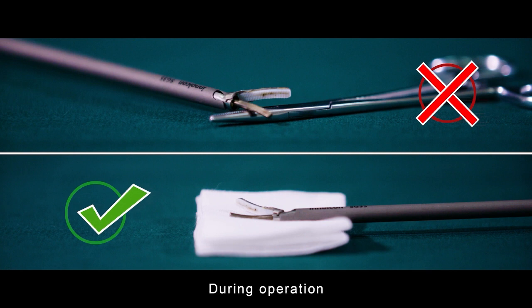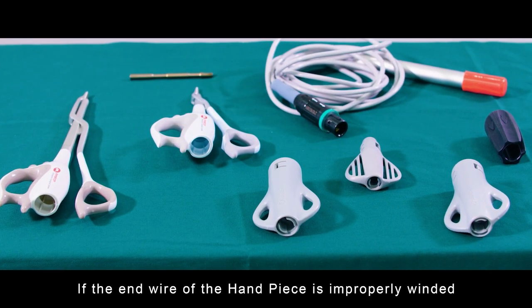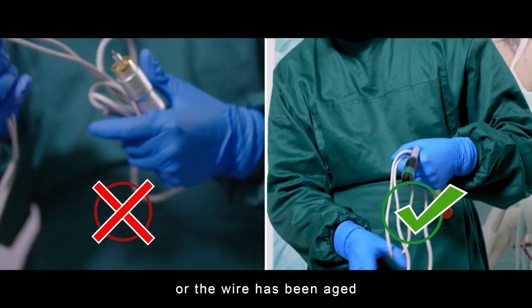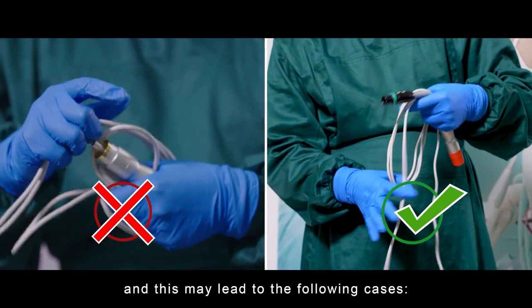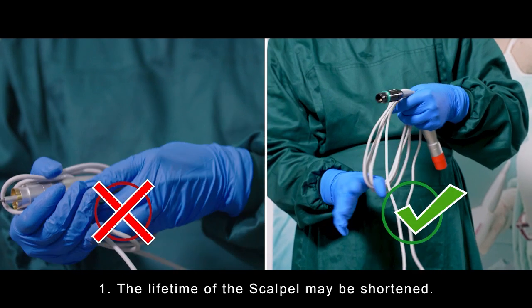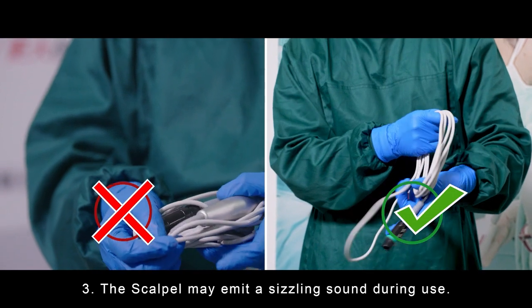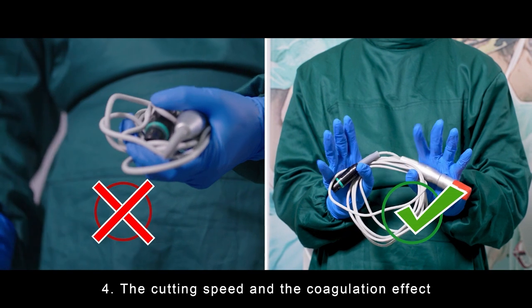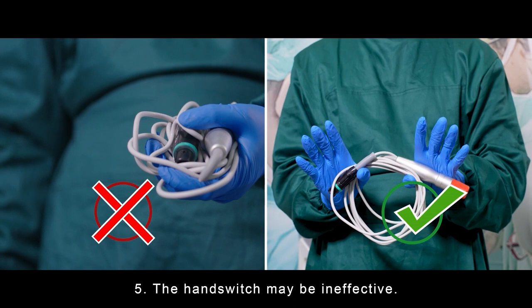Scalpel. During operation, avoid touching any metal objects to prevent small cracks or fractures. Handpiece. If the end wire of the handpiece is improperly wound or the wire has been aged, the output power of the handpiece may be unstable, and this may lead to the following cases. The lifetime of the scalpel may be shortened. The scalpel may be damaged. The scalpel may emit a sizzling sound during use. The cutting speed and the coagulation effect may be performed negatively. The hand switch may be ineffective.